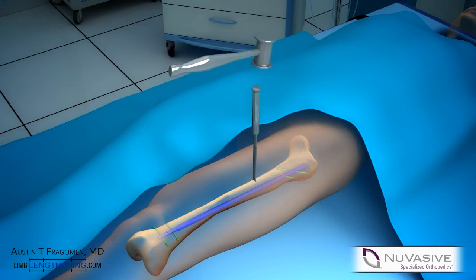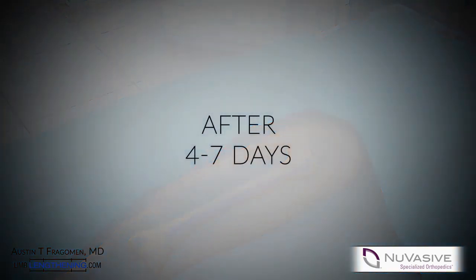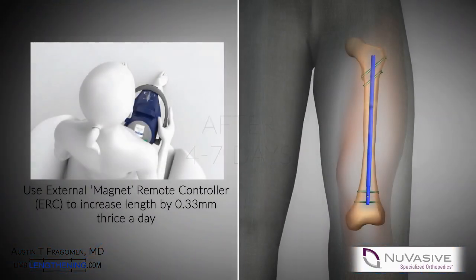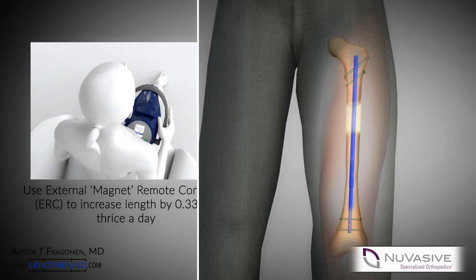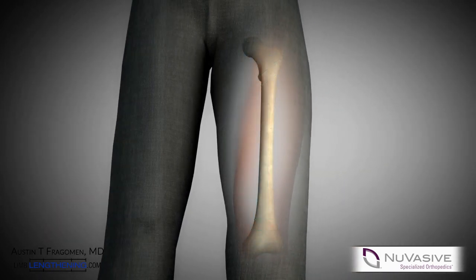Great care is taken to avoid contact with the nail. A latency period is then observed, and then the external magnet is applied in distraction mode, which requires a quick reprogramming. The bone is then distracted at a typical rate of about a millimeter a day. The patient is followed regularly to change the distraction rate if needed.